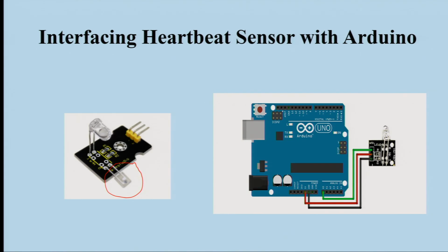You can see this particular sensor comes with 3 different pins. One of these you will be connecting to VCC, another you will be connecting to ground, and the third pin is your signal pin. These 3 pins, as we have seen in the diagram over here, you can connect with the signal on an analog port, and the remaining 2 will be your simple power connections for VCC and 5 volt. The same sensor you can also connect on the digital port, where it will show the pulse counts based on your initial threshold setups in your software code. In our case, we will be showing it on a serial plotter.